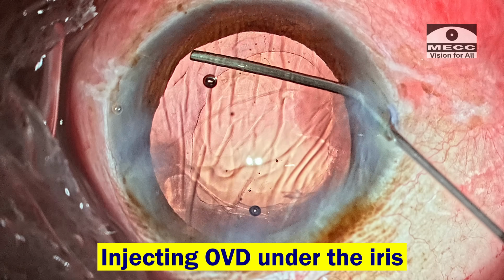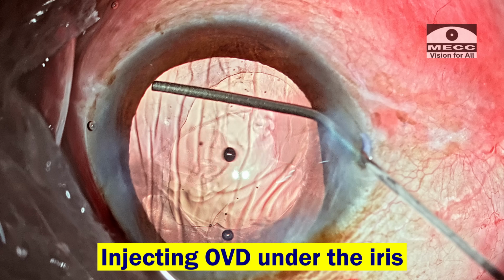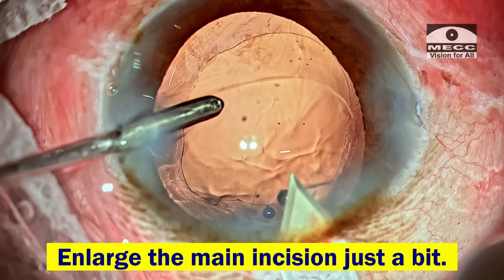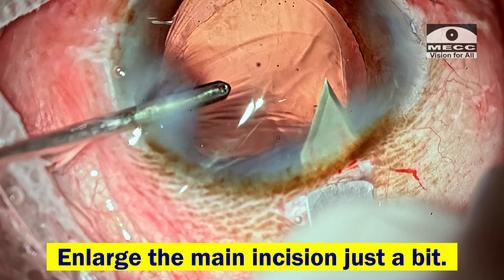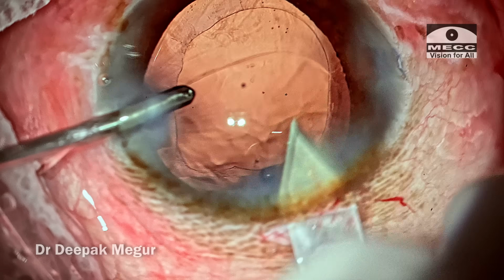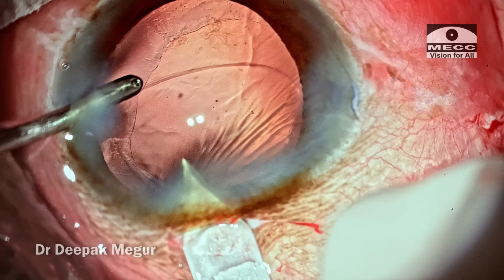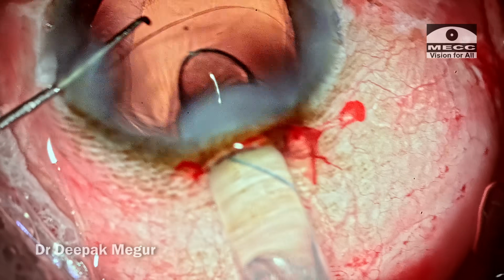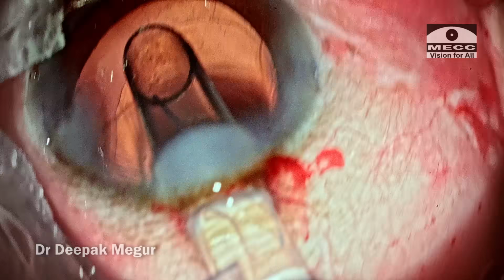Space is created in the sulcus by placing OVD under the iris and above the anterior capsule. I'm going to use the blade to enlarge the incision just a bit. Remember, when you do anterior vitrectomy, the eye would be soft, and it would be difficult to negotiate the cartridge through a regular size incision. A larger incision does make the job much more simple and effective.